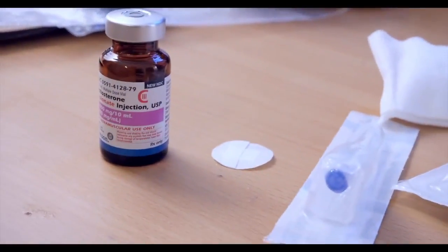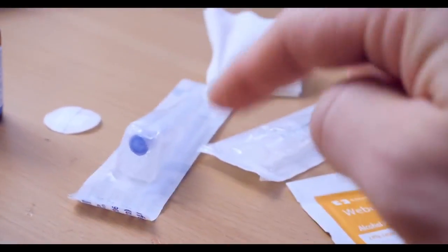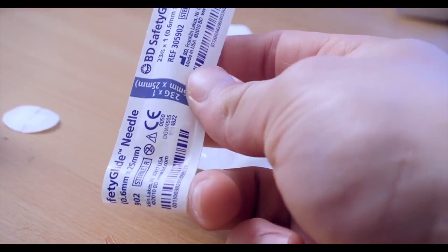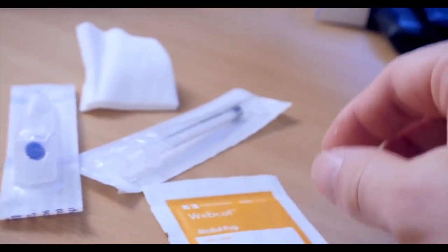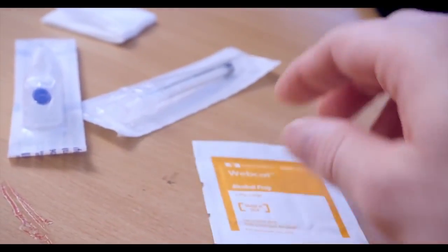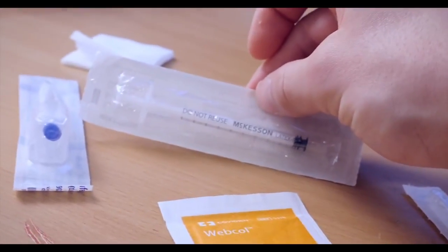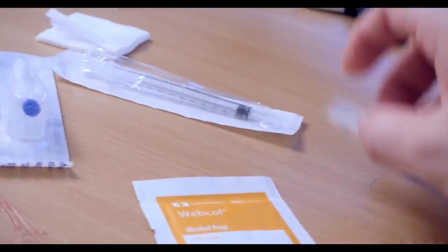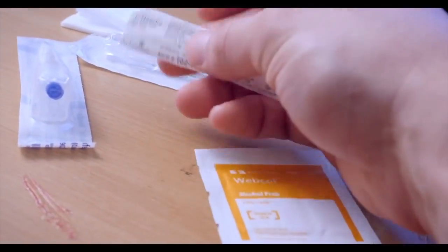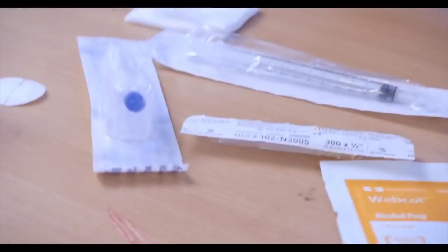The basic supplies: we've got the testosterone itself, a little band-aid, and this is the needle I use to draw — it's a 23 gauge needle, kind of slow, I wish I had something bigger. We also have a little cotton swab, an alcohol wipe, the actual syringe itself, and then I actually like to inject with this little guy — it's a 30 gauge.